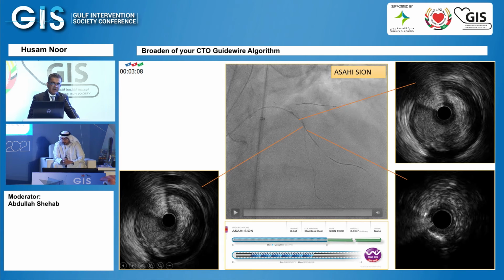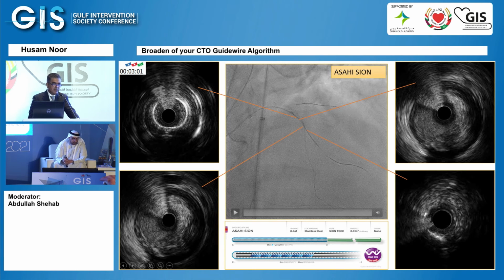So I have a short area in the subintimal space. And then, as we discussed earlier, in the proximal segment there is 360 degrees of calcium. So we're probably going subintimal space, true lumen, subintimal space, true lumen. And we need to connect all these together.